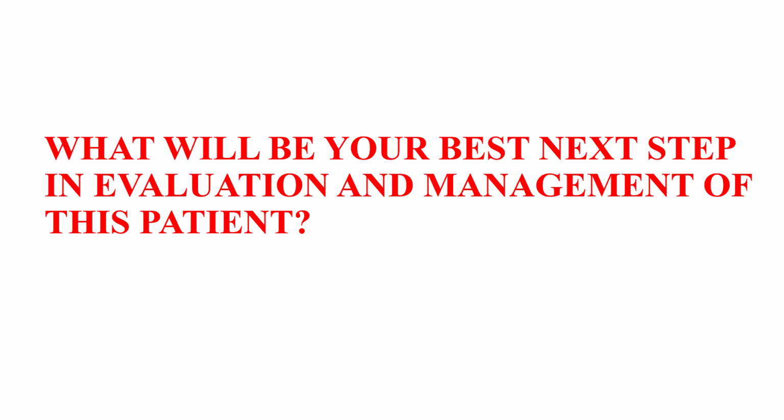I don't know the modalities of stress echo. So treadmill, dobutamine. Do you mean treadmill or dobutamine, or dipyridamole, adenosine? Which option will you prefer? Or let me say treadmill stress echo and pharmacological stress echo, specifically dobutamine. Between these two, which option will you go for?